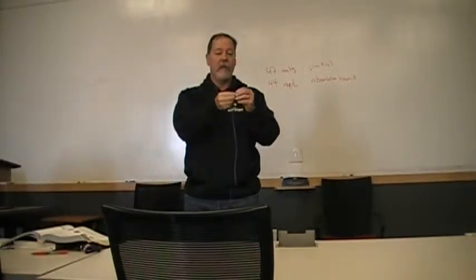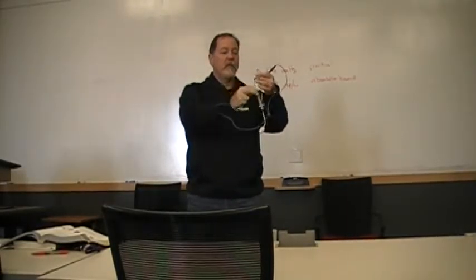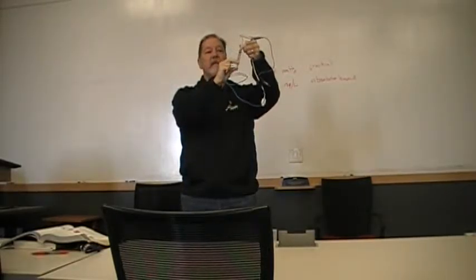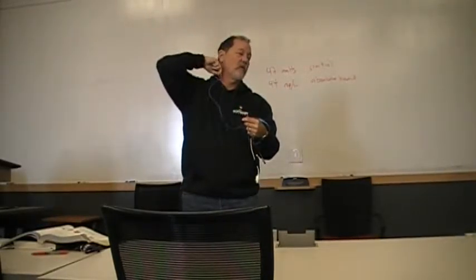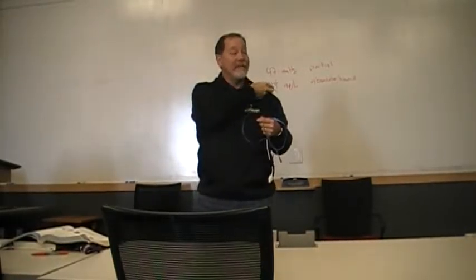You'll notice at the end, the balloon's gone on the end of this. But with this syringe, the syringe will usually go a cc and a half, and this balloon will take a cc and a half of air. It'll open up the balloon. The balloon will take the path of least resistance and go through the atrium, past the tricuspid valve into the ventricle, and into the pulmonic valve into the pulmonary artery, and sit there.